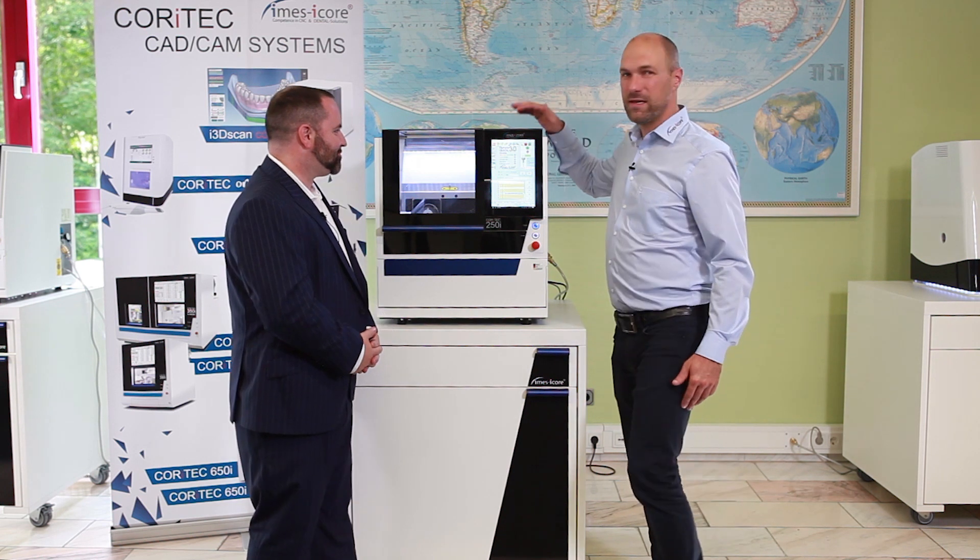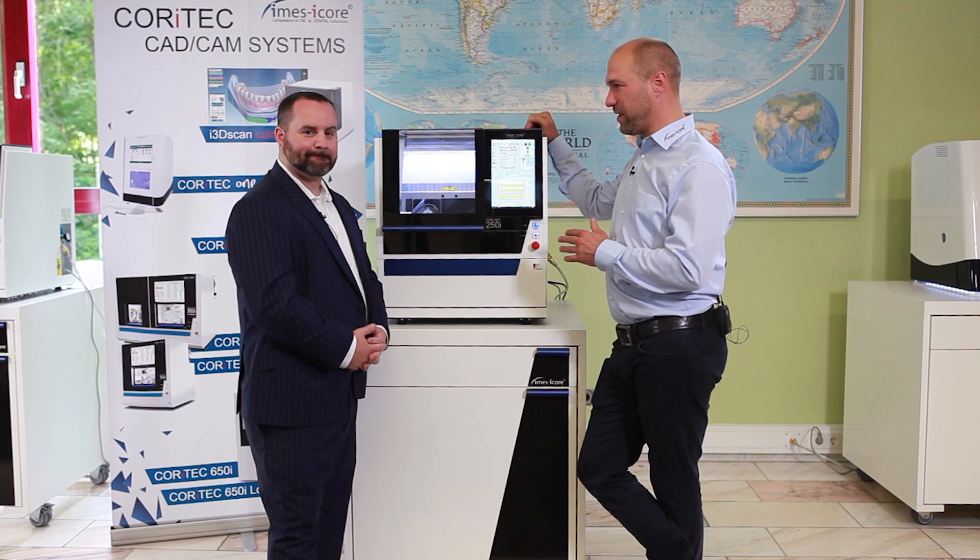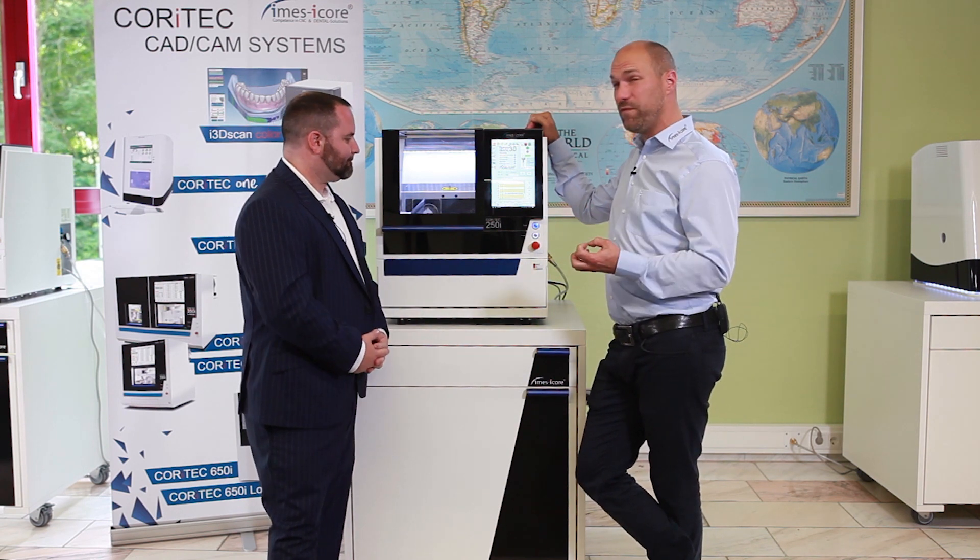Michael, tell me a little bit about this one. So this unit we developed in 2013, some years on the market, but it's actually the fourth model from that machine. We continuously improve the machine and it is available in four versions — as a 4-axis or a 5-axis mill, and as a dry milling machine or wet and dry milling machine.